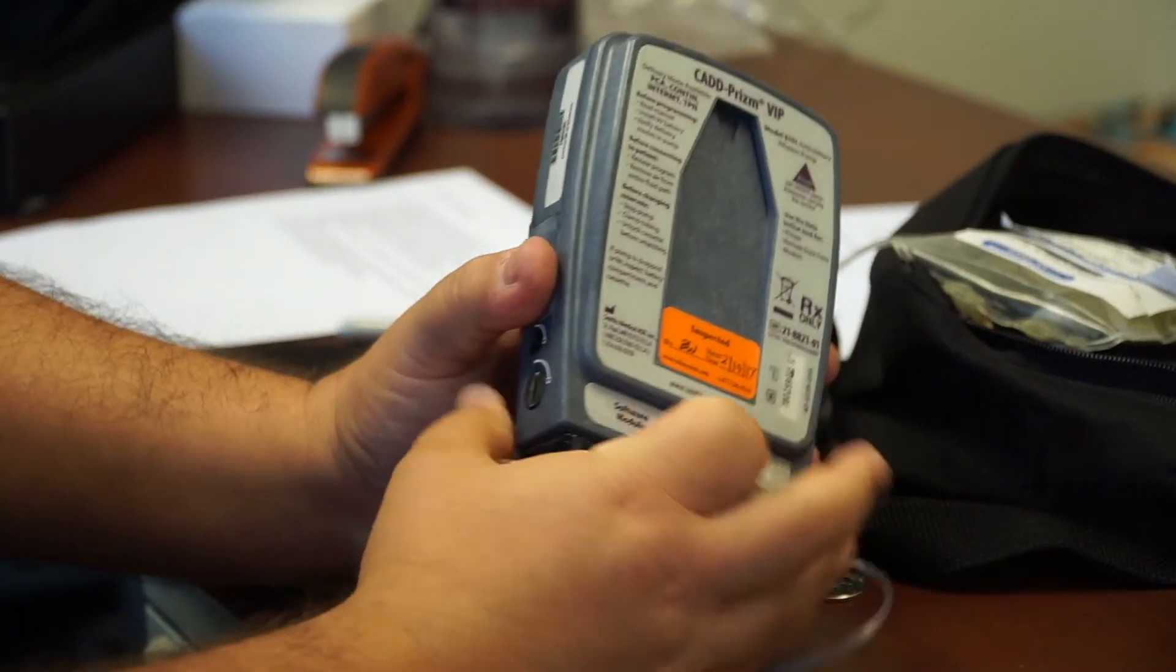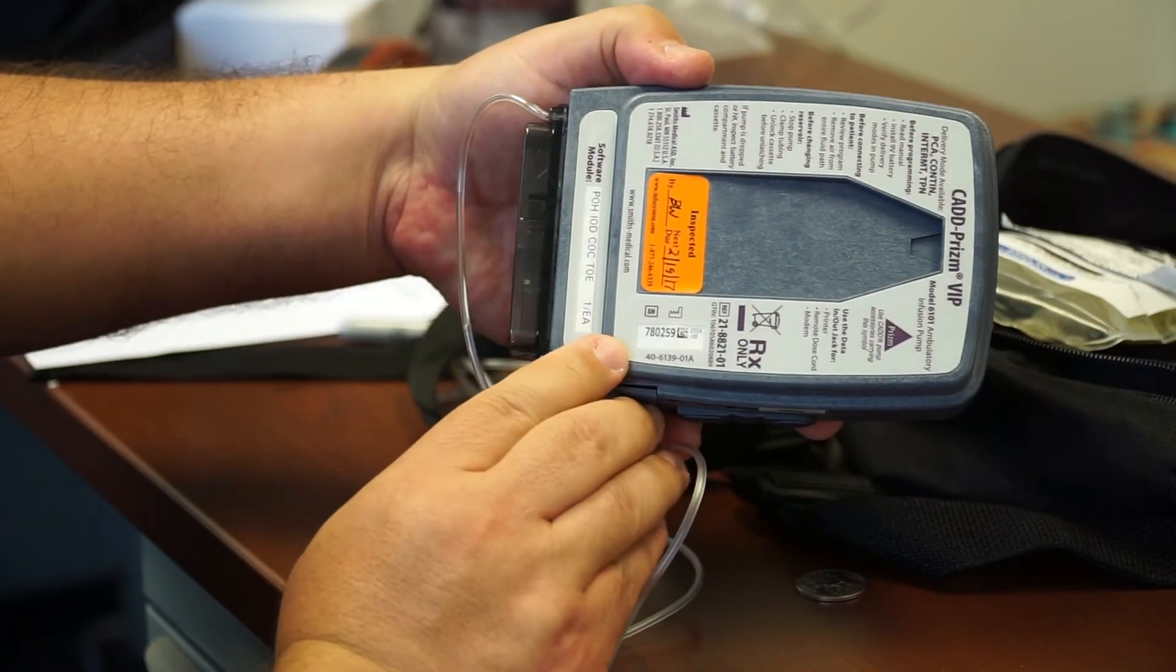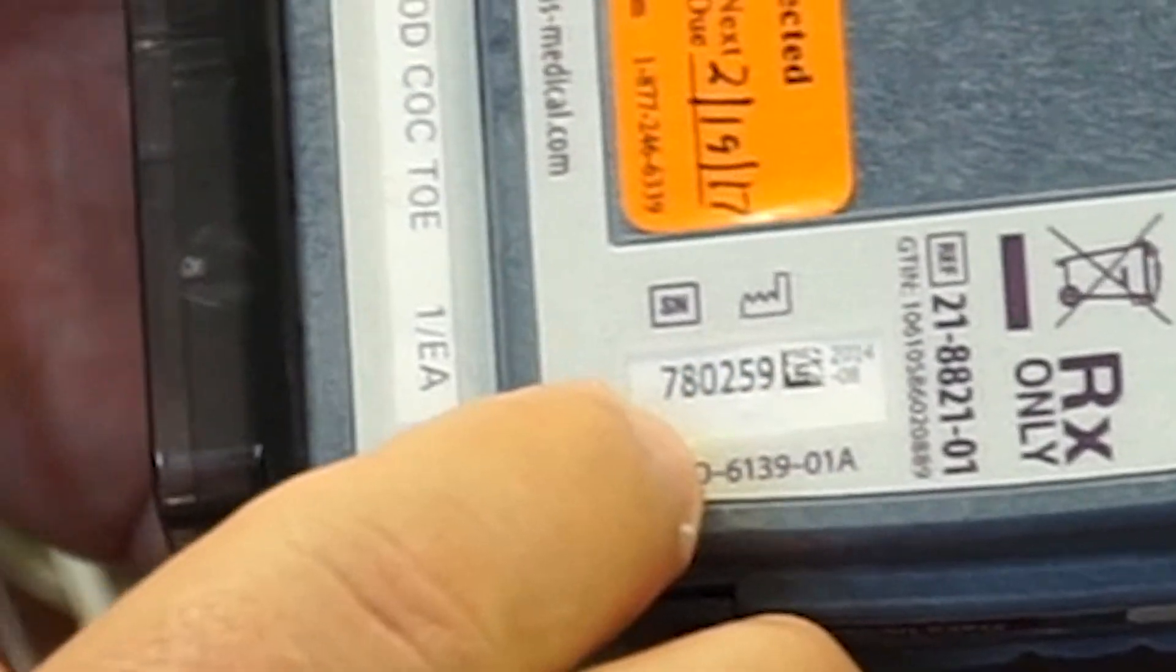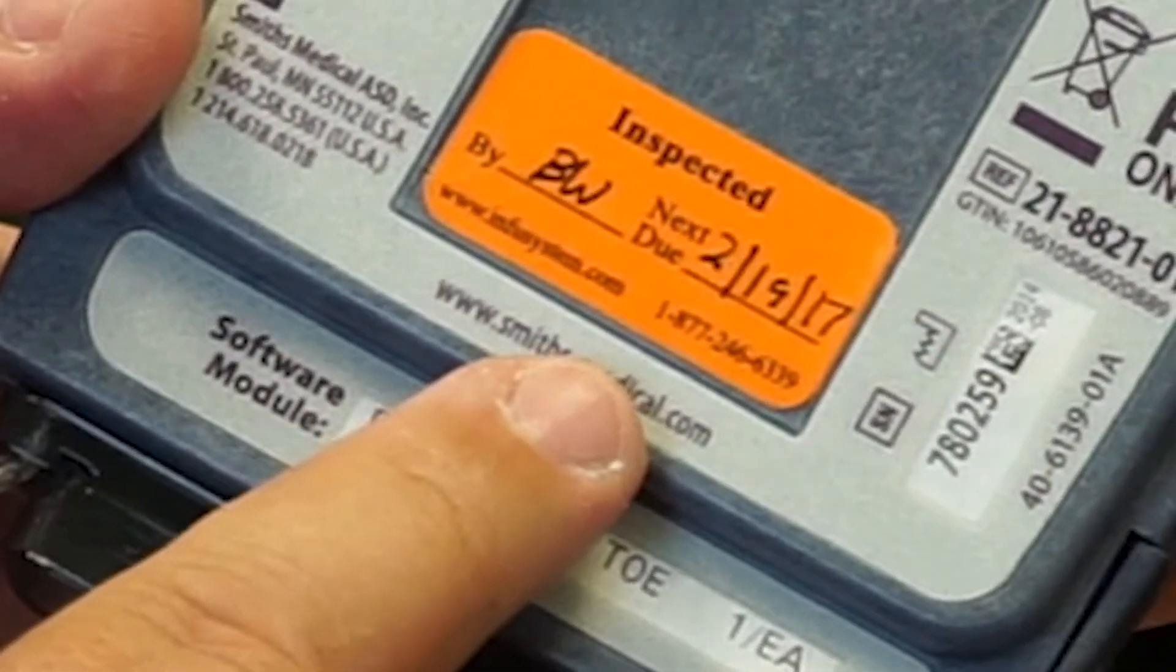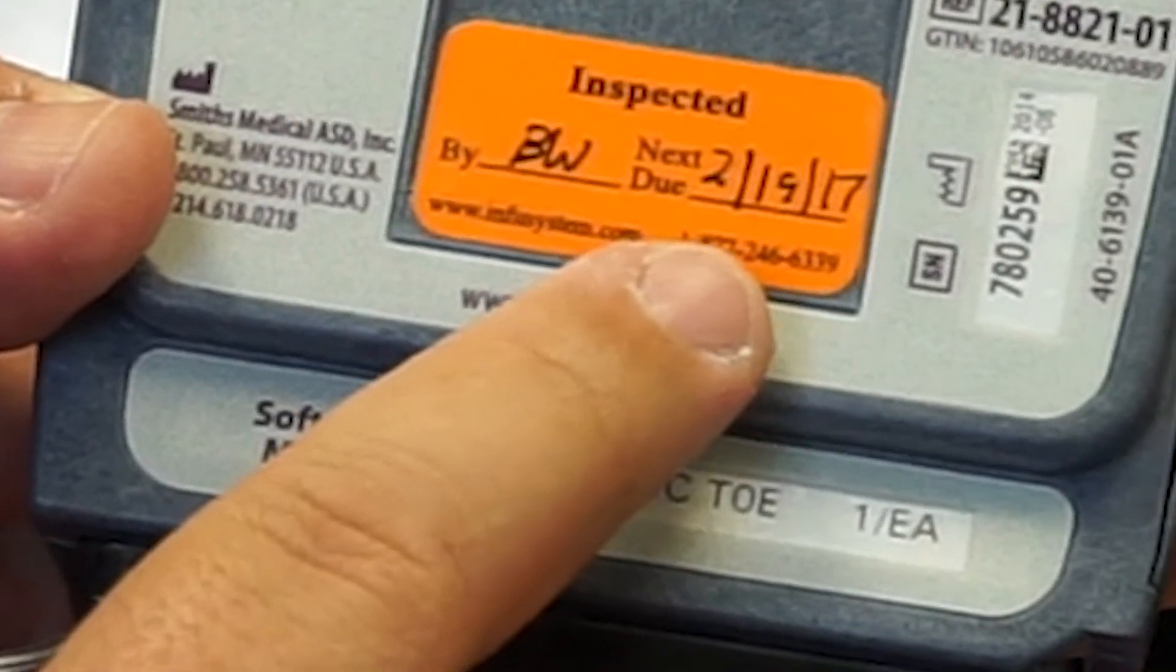The serial number is typically on the back. And you can see this number here. This particular one is 780259. And it will also have a calibration date. So, there will be an orange or yellow sticker on there with a date that says next due date is by a certain time.